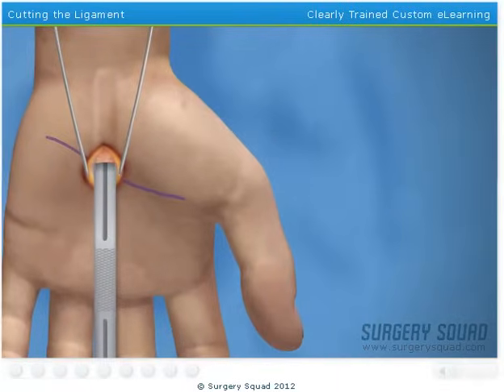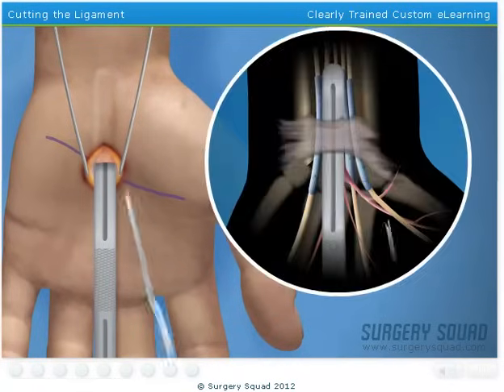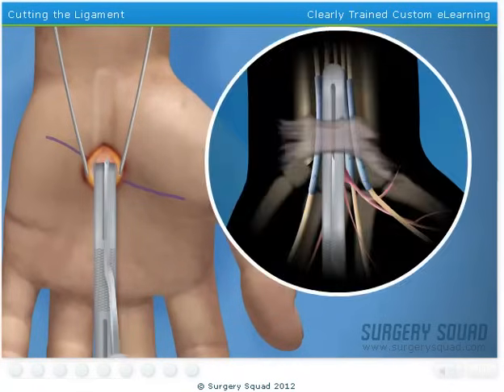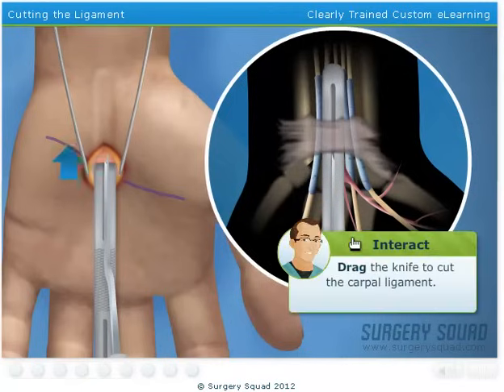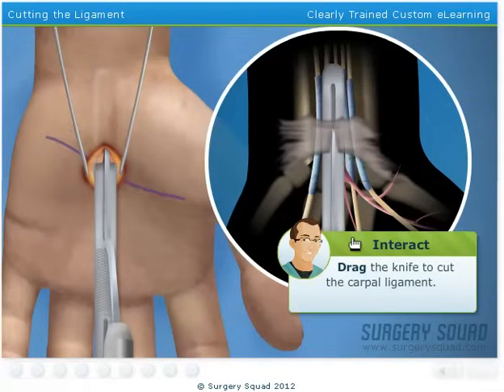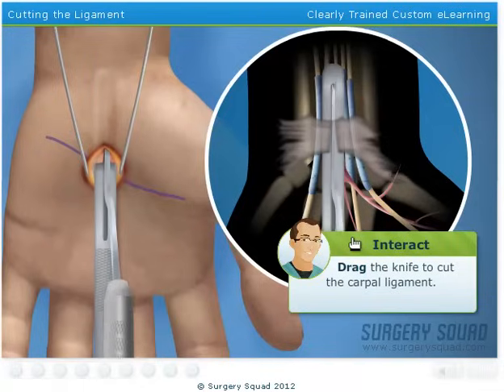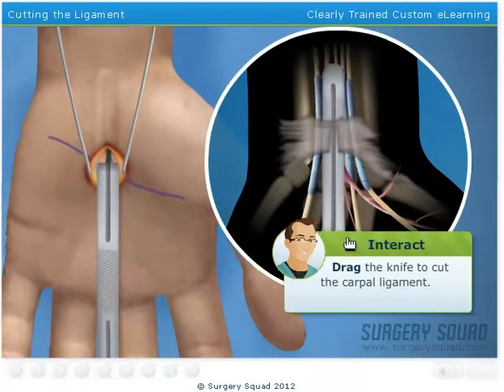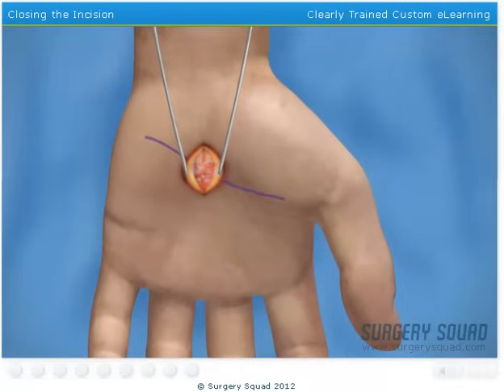Once it's in position, you'll advance our special knife down the guide to split the carpal ligament. As you push the knife forward, you will feel it cutting through the carpal ligament. With the transverse carpal ligament cut, the median nerve is no longer inflamed. Now we can begin to clean and close the incision.